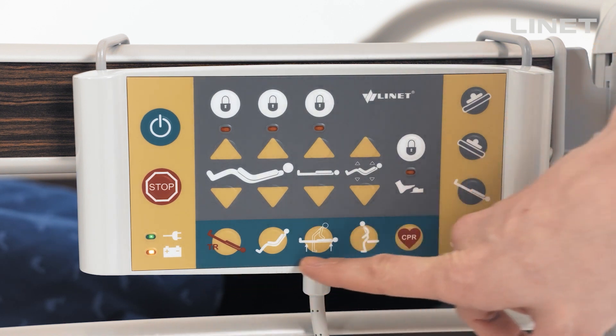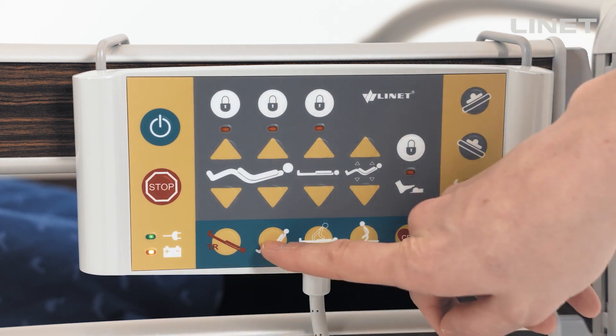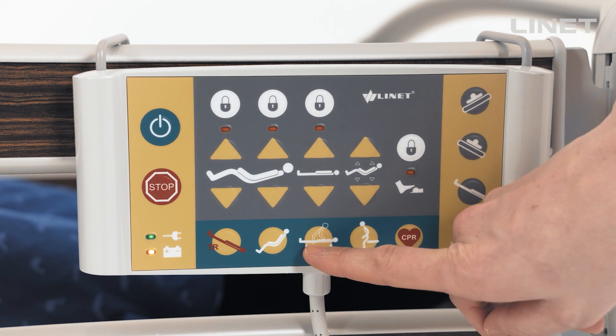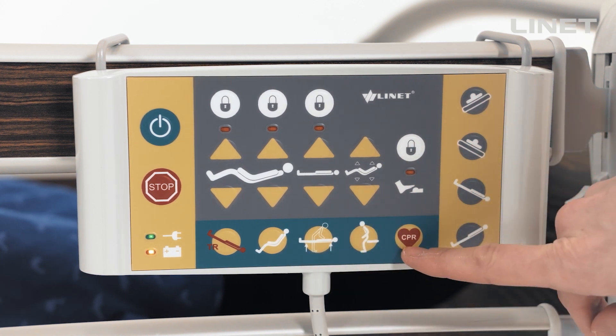All preset positions are on the bottom: red Trendelenburg, cardiac chair position, examination position, mobilization button, and red CPR button.